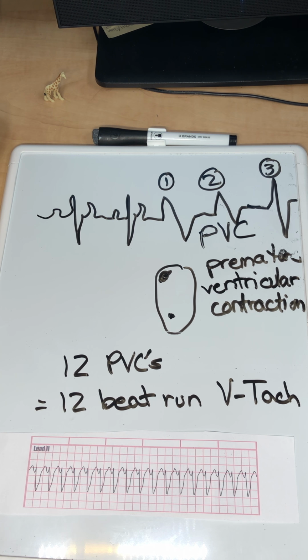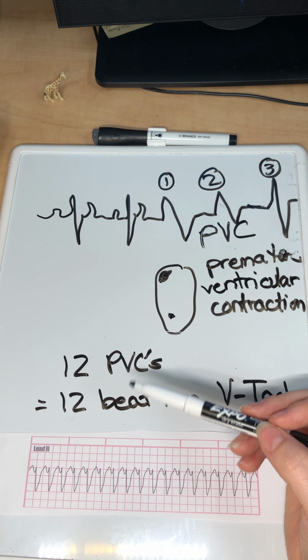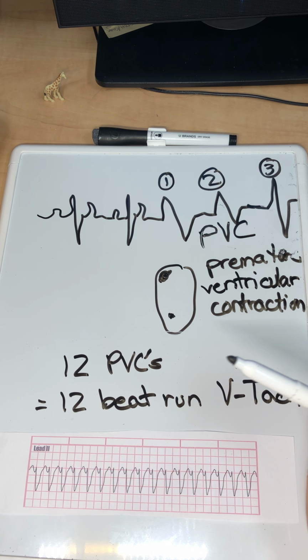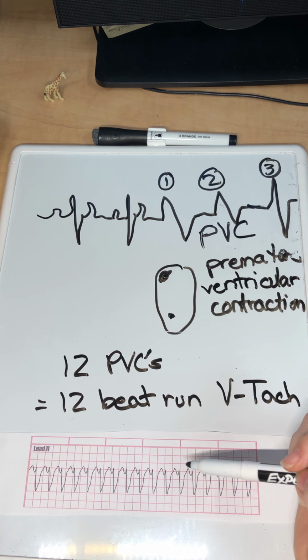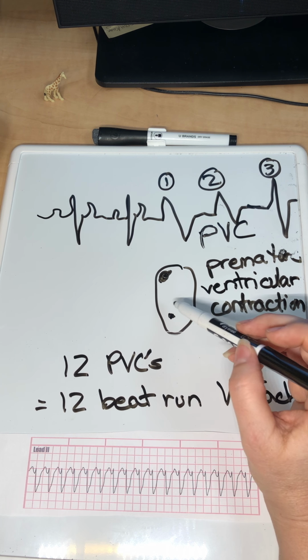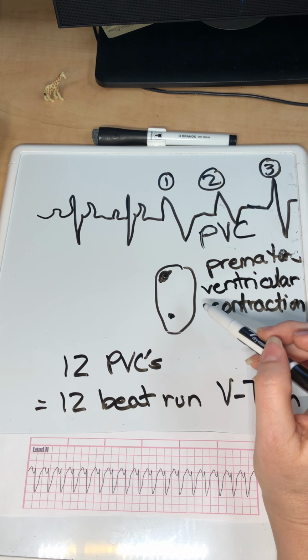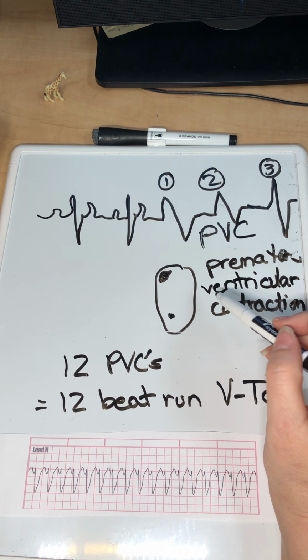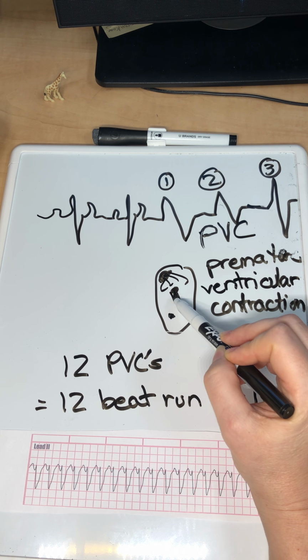Now, it might be perfusing, and maybe it doesn't affect the cardiac output right away, but when you see a patient having this many PVCs, when they start to have a lot of PVCs, first of all, you need to check their electrolytes. But actually, before checking electrolytes, get a blood pressure and see if these beats are perfusing, because maybe the patient is still getting blood to all of his or her cells, but you will likely see that their cardiac output will start to be impacted by these PVCs, because you're not getting your normal pathway, right?